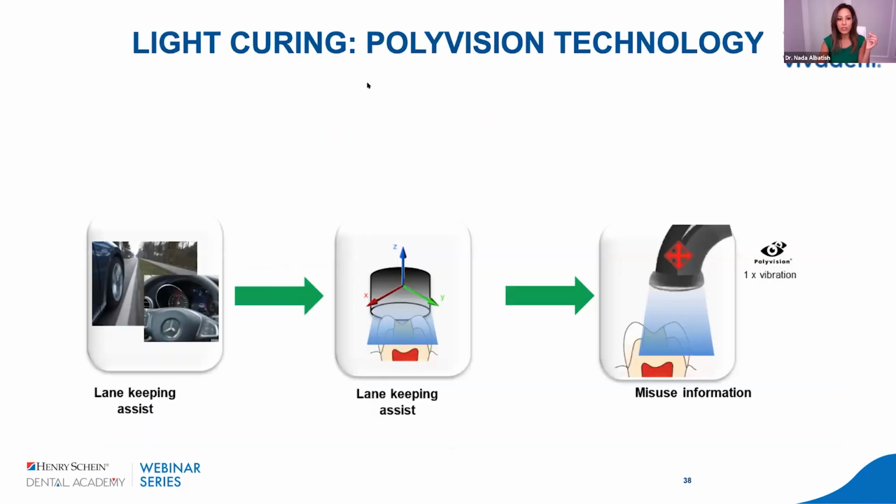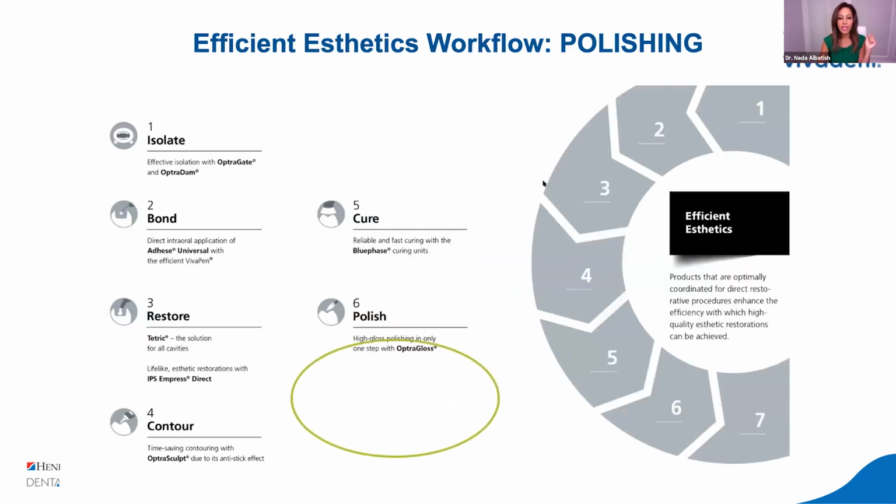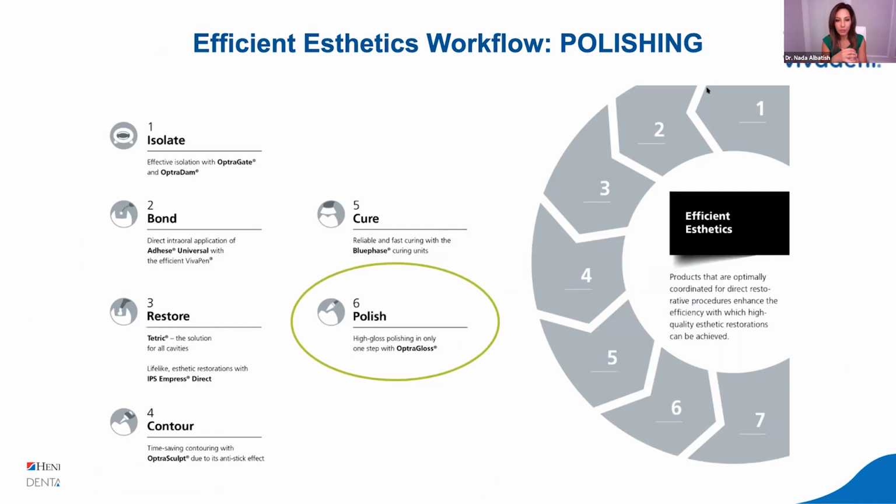So it really works like the lane assist in all our new cars, right? It just helps you stay in your lane, and if you go off your lane, it alerts you. And that's what I wanted to talk to you about in relation to curing.